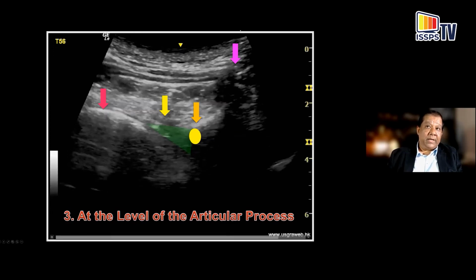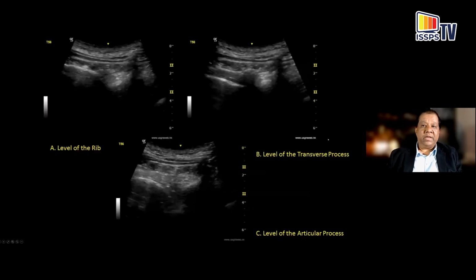However, there is emerging evidence that injecting closer to the foramina is clinically beneficial, and I will come to that later. We usually inject somewhere between the apex and the foramen. So somewhere here is where we would guide our needle for the interest of safety. And so this is again to illustrate to you the three sonographic windows that you need to learn to acquire, and I will show you that in the demonstration.